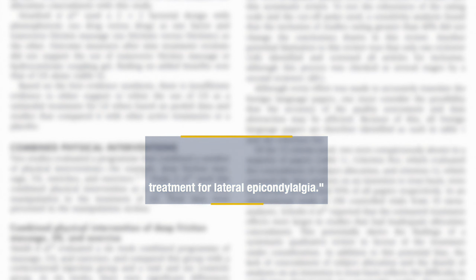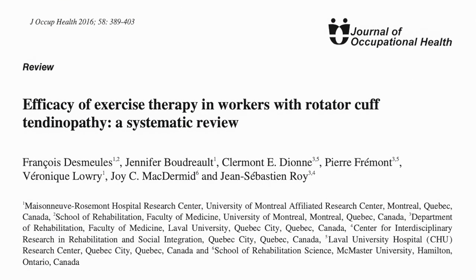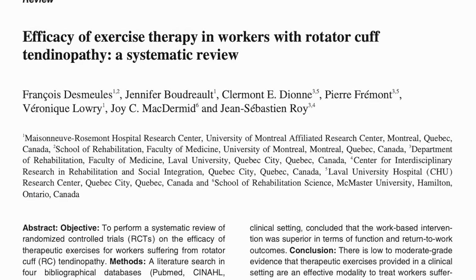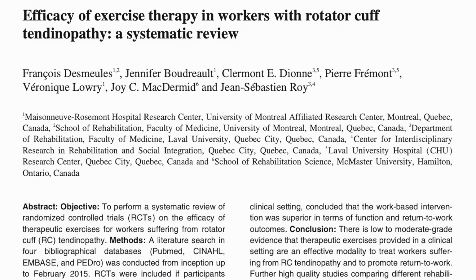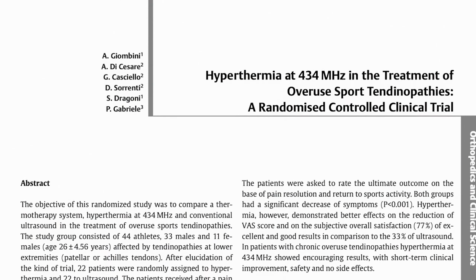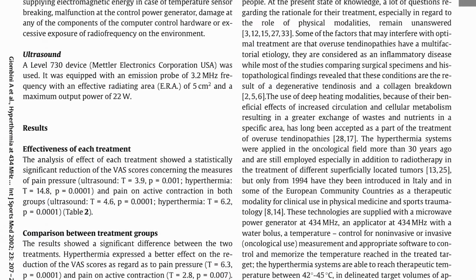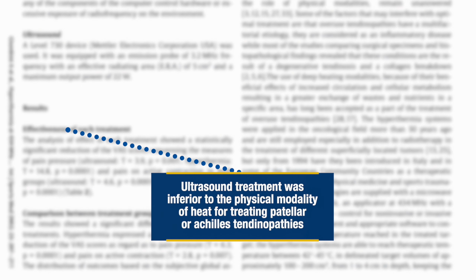And another systematic review for rotator cuff tendinopathy found therapeutic ultrasound to be inferior to laser therapy and of no greater benefit than placebo. And then another single RCT comparing hyperthermia treatment or heat therapy to continuous ultrasound in patients with either Achilles or patellar tendinopathy concluded that ultrasound treatment was actually inferior to the physical modality of heat.